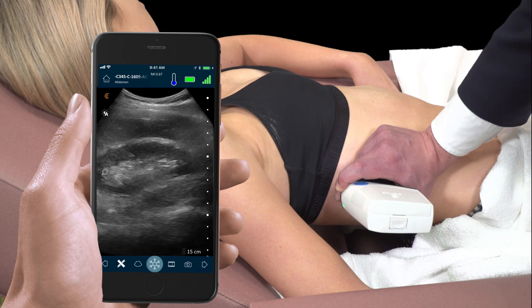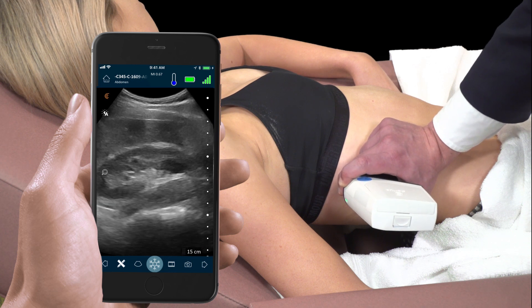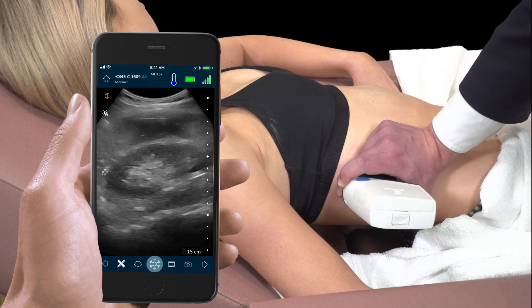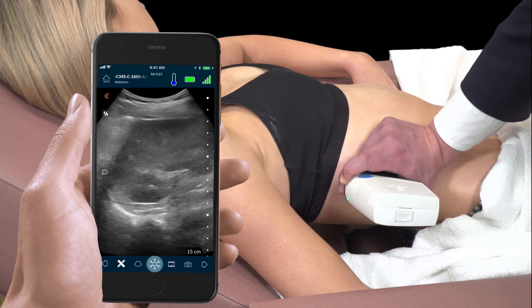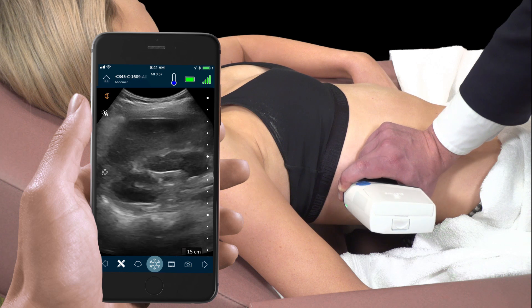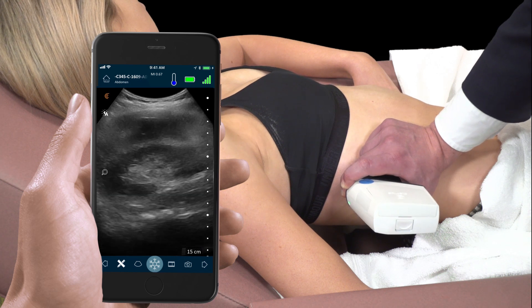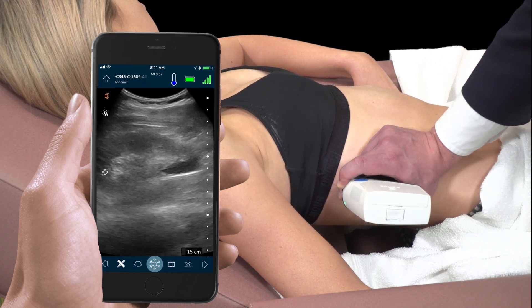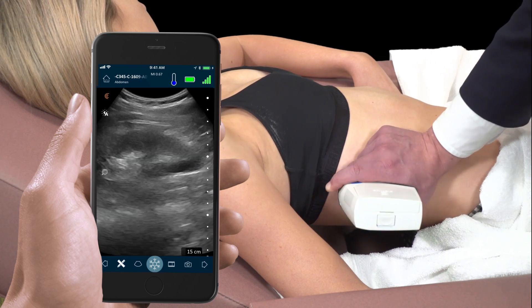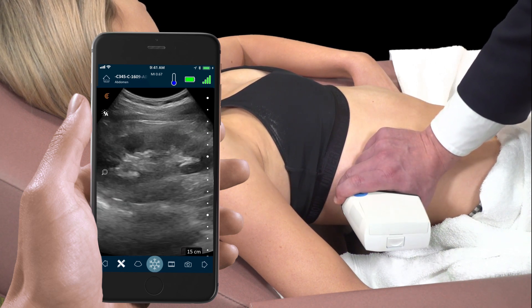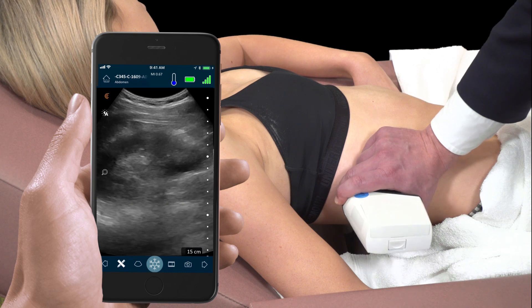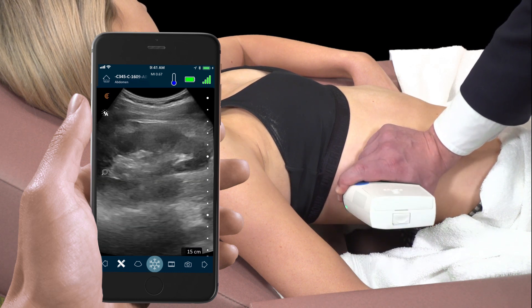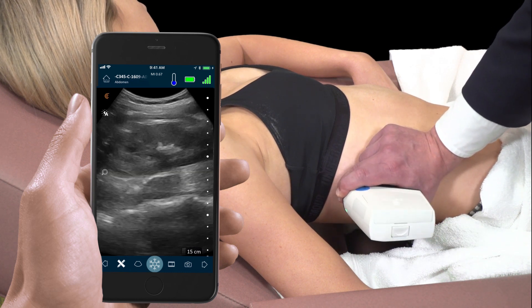In states of renal pathology, the renal parenchyma is hyperechoic, or brighter, than the hepatic parenchyma. Now we fan through the right kidney, looking for any evidence of hydronephrosis.